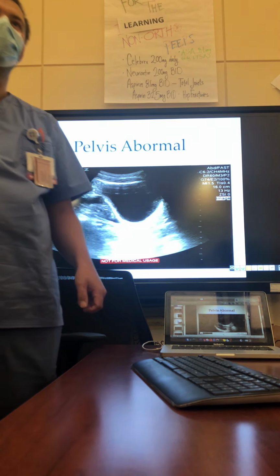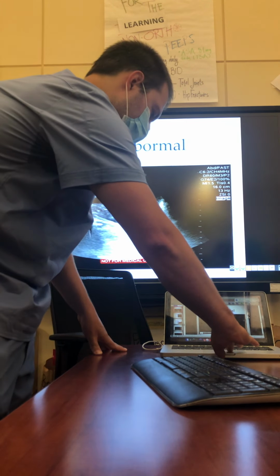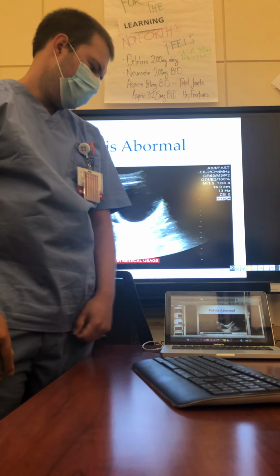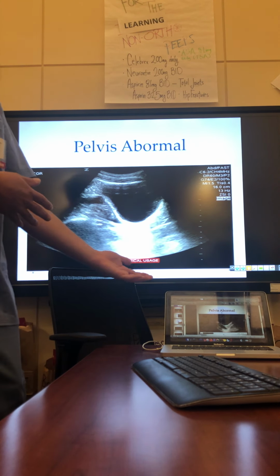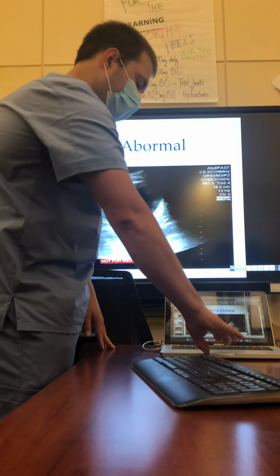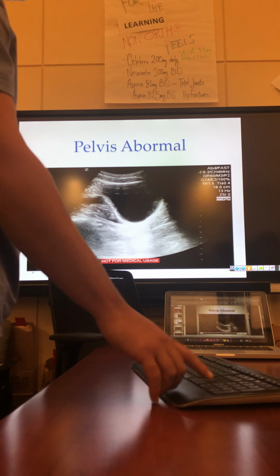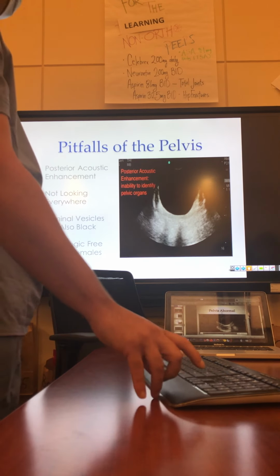The dark stripe, right? Yep, and you can also see it up there. As we scan through, you'll see it popping down here as well. Right there, see? Again, in a menstruating female, this might be normal. This might be physiologic fluid. I think that would be kind of a lot, to be honest. I would be suspicious that there's something else going on. But again, it could be a ruptured cyst or just physiologic fluid.